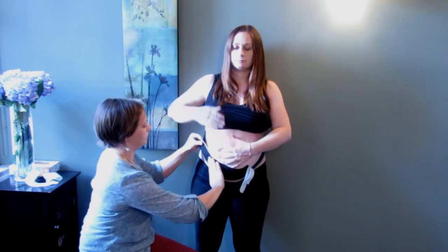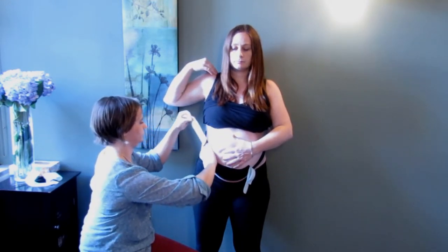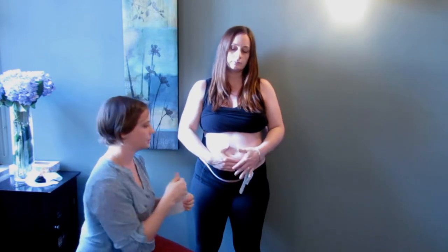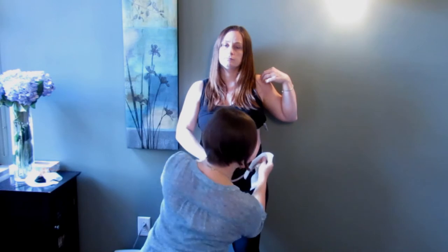On the outer thirds, apply no tension. It's really important that you don't put any tension on the outer thirds, because you want to prevent any skin irritation or rashes from the tape.